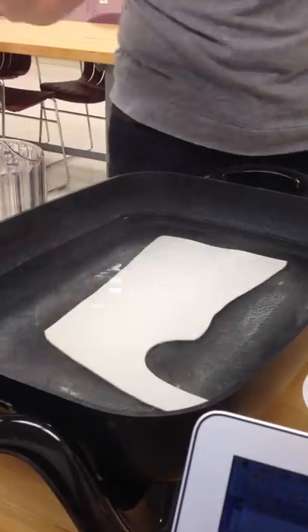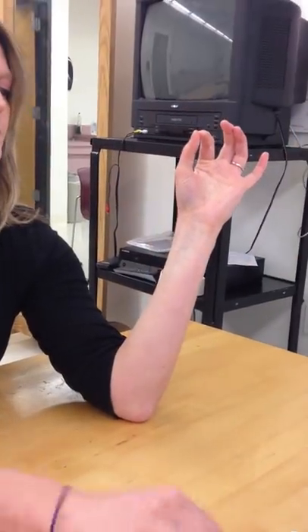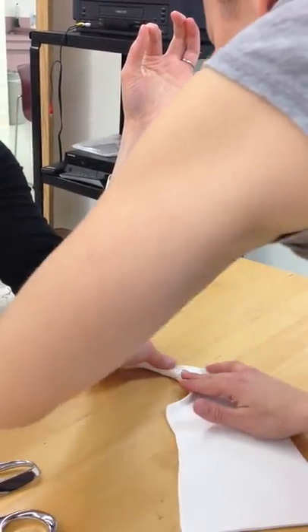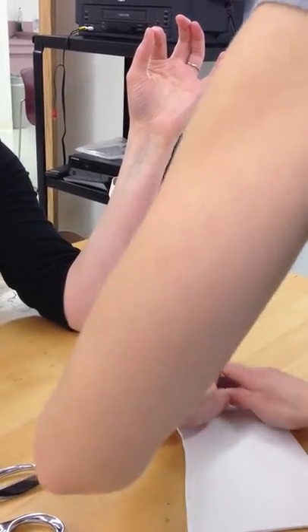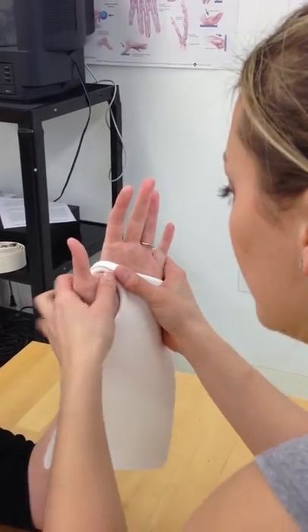The patient is going to be positioned with their elbow up. I will roll the material to make it nice and comfortable for the patient in the thenar area — on top here, before I even put it on. I'll make sure I'm below the distal crease. Nice, soft hands.